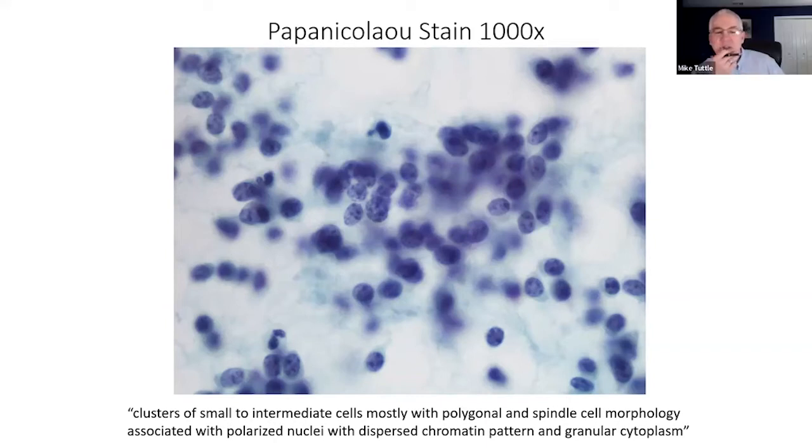And Zubair, can I ask you, on the bottom here, it says spindle cell. And spindle cell to a lot of us always means anaplastic and rings the bells. Can you say a little bit about that spindle cell?